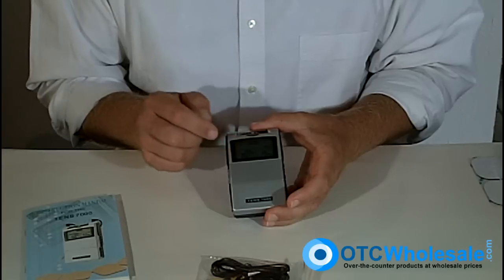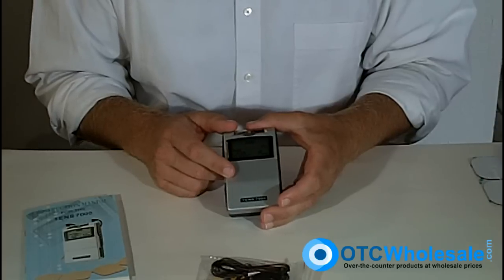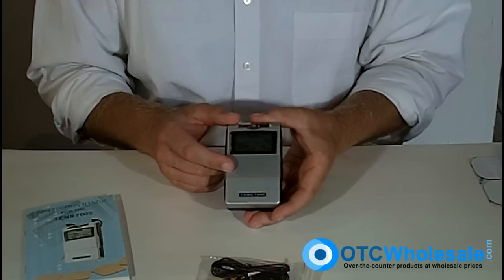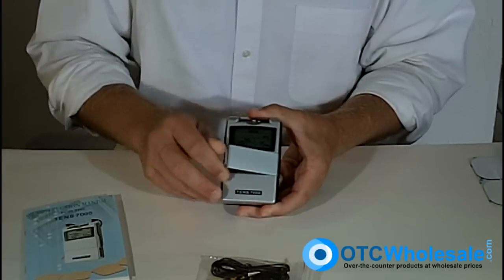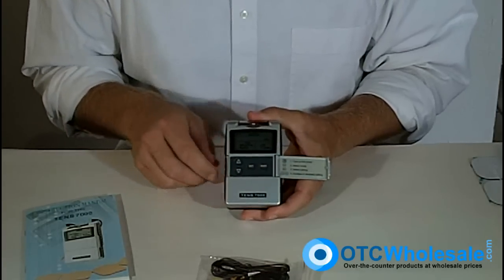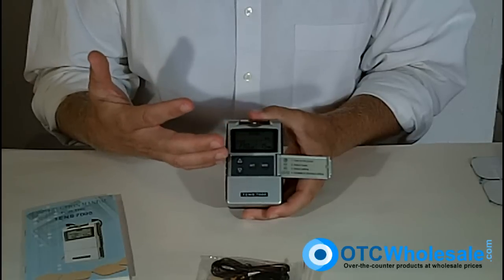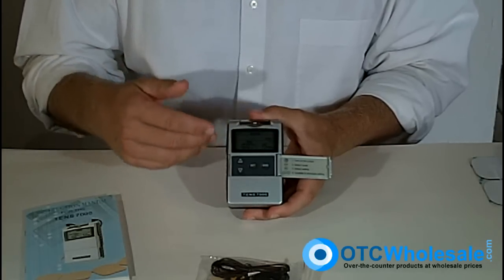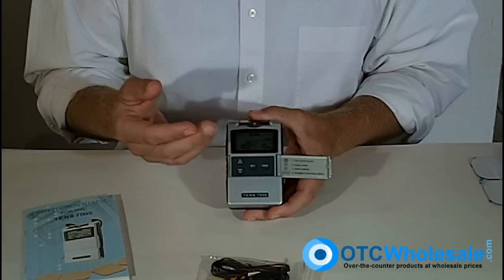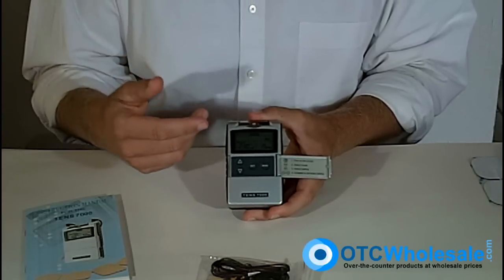I can adjust the width, the rate, and the time. It's got a timer from one to 60 minutes, and that's very easy to adjust. I simply open up the front cover and here I've got a mode button — it goes through the five different modes of this TENS 7000. The TENS 7000 has five different modes, plus you can change the rate and width of the wave and adjust the timer.